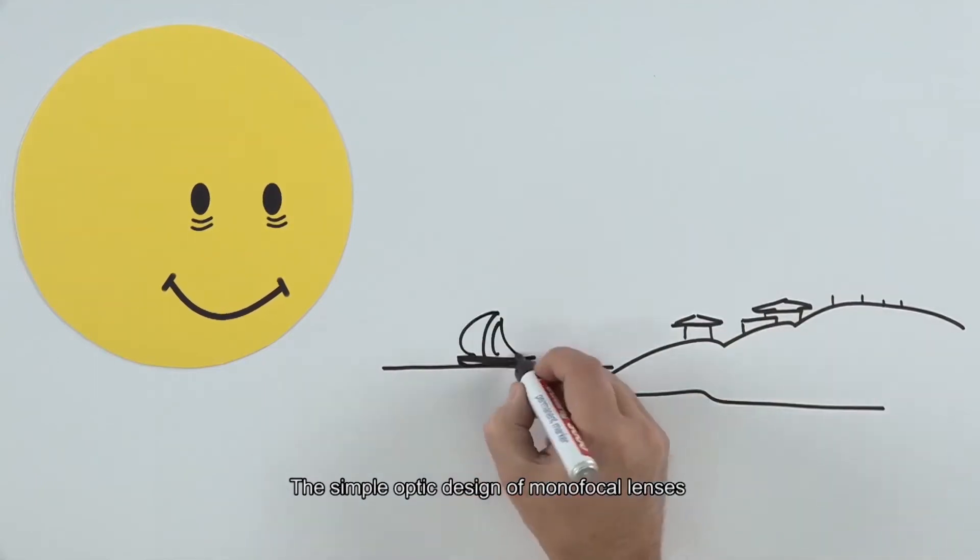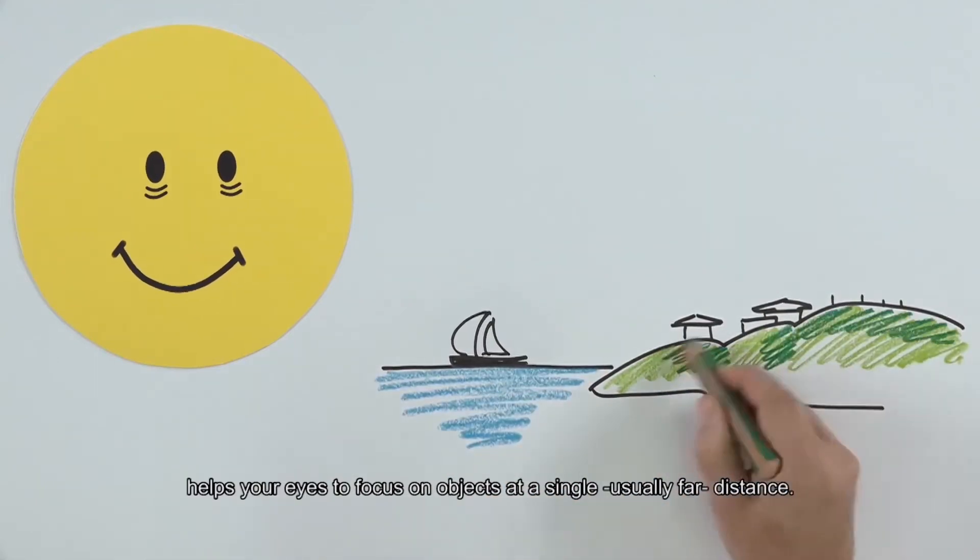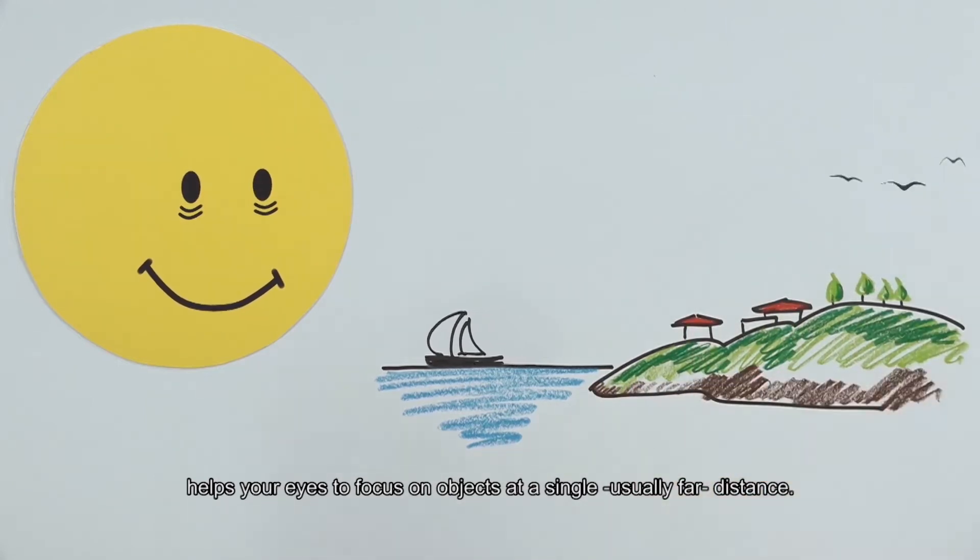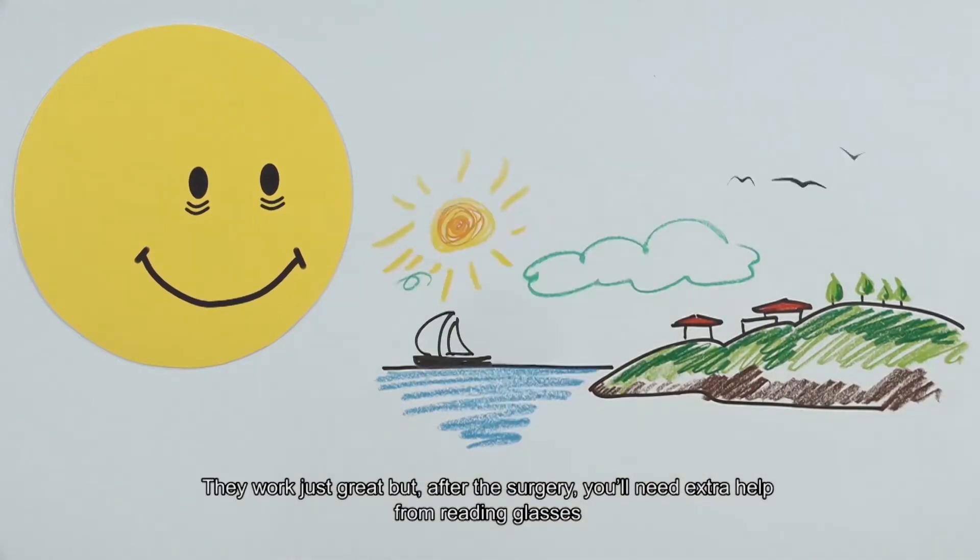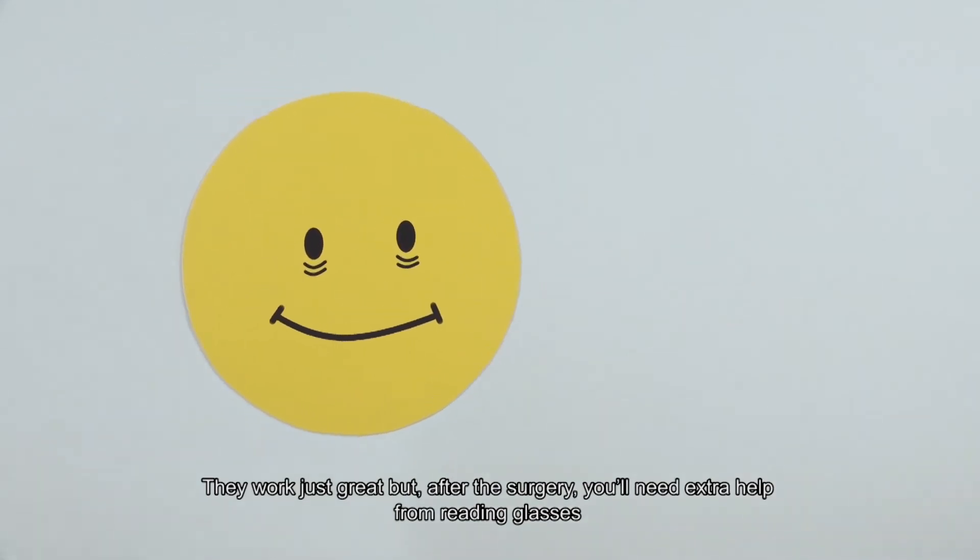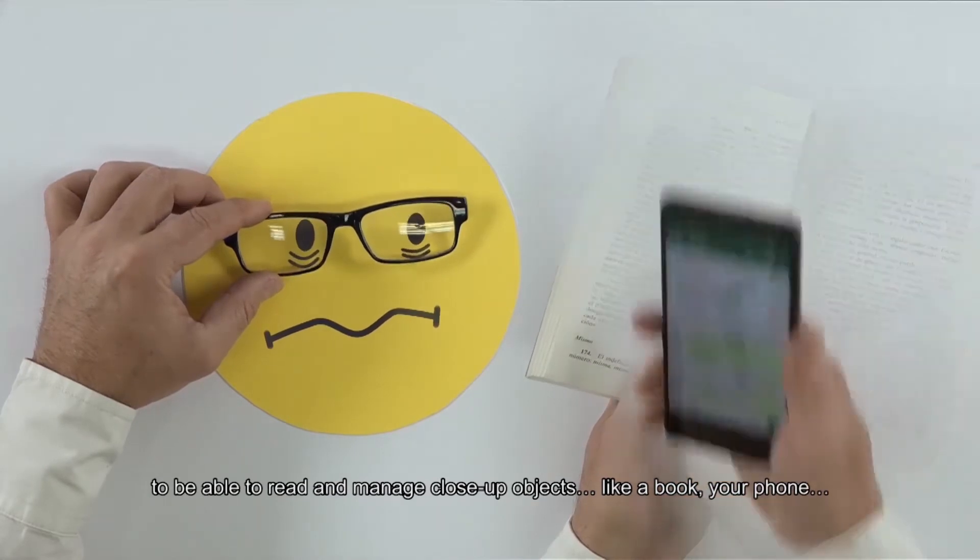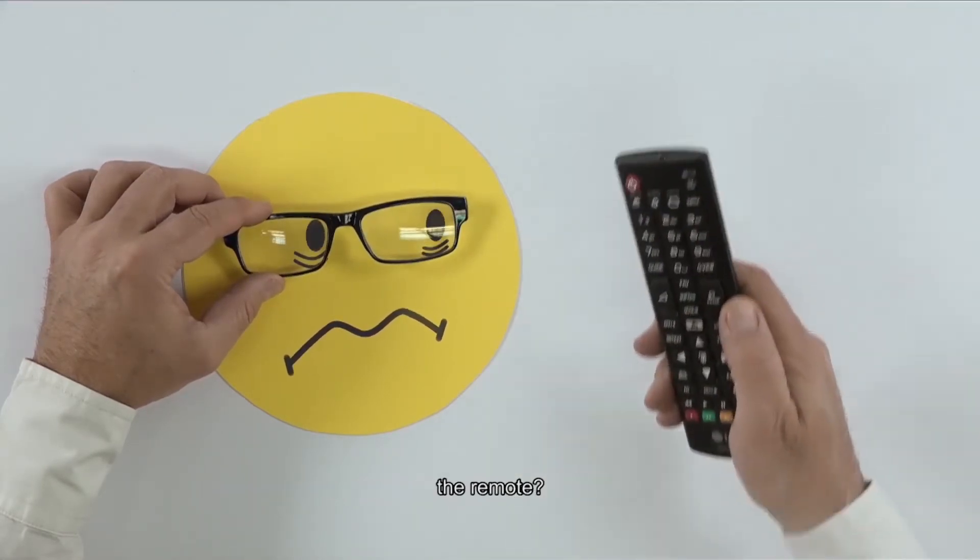The simple optic design of monofocal lenses helps your eyes to focus on objects at a single, usually far, distance. They work just great, but after the surgery you'll need extra help from reading glasses to be able to read and manage close-up objects, like a book, your phone, the remote.